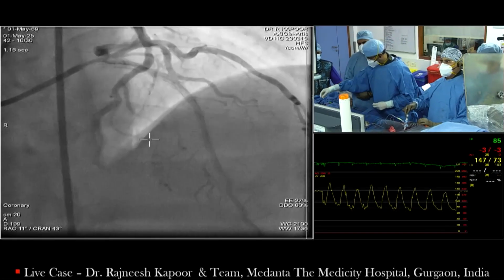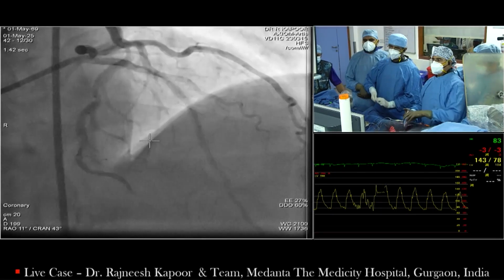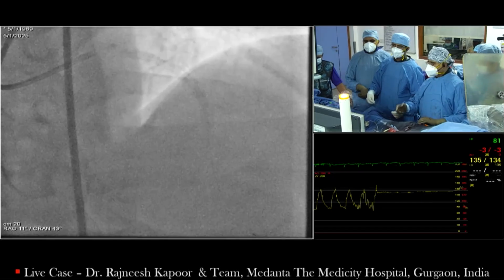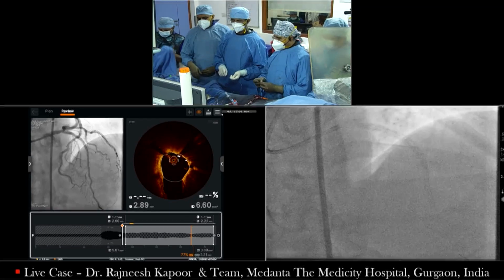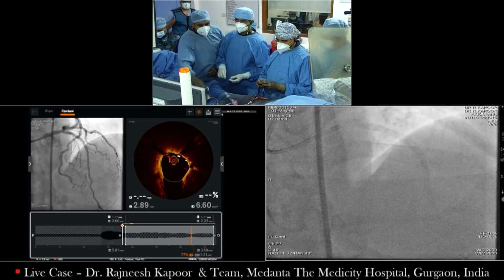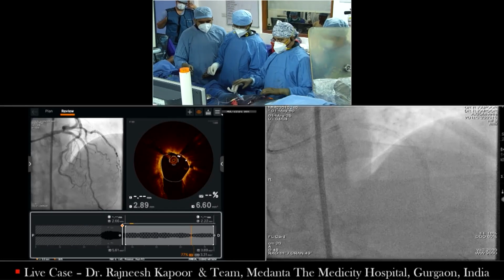Yeah, I think great cases, both of them. Really, the key message is the planning and the preparation. That's the most important. One thing I would like to say is that we do it, and especially when we are not planning to use the support device, that we always check the LVEDP, and that gives us good information and prepare the patient accordingly beforehand. Absolutely. Always.